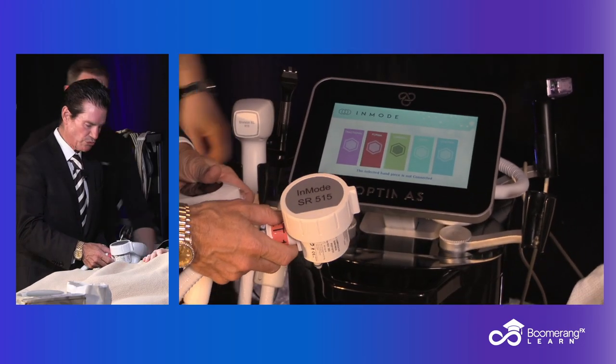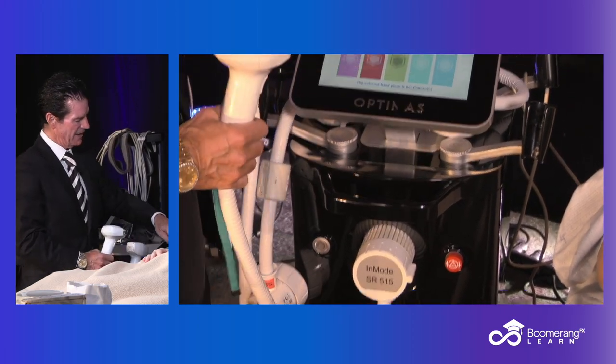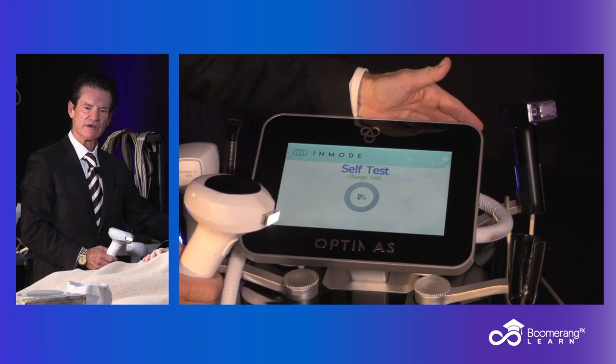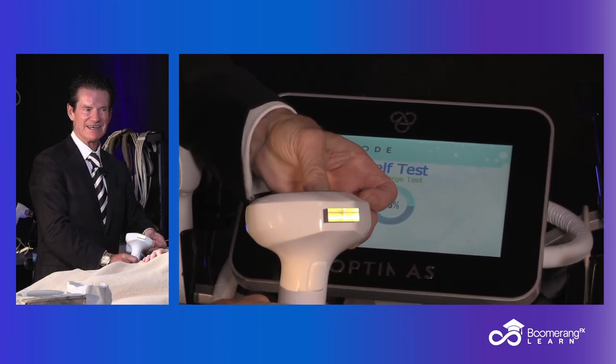I'll just show you how you change applicators. You quickly take your diode, you take your 515 and your 580. And that's it — you turn it on. Now it's going to recognize the applicator and go through a little self-test, check the flash lamp. And you can see now it looks kind of greenish, yellowish — that's because it's a 515 cutoff filter.